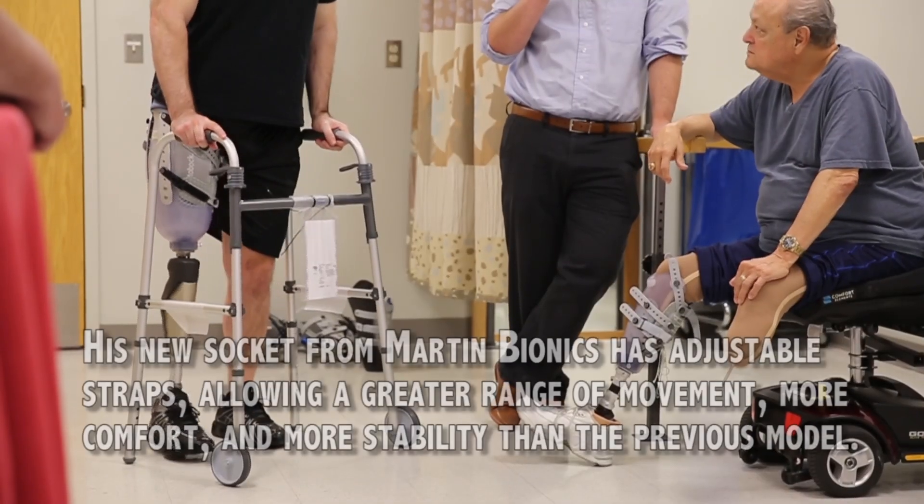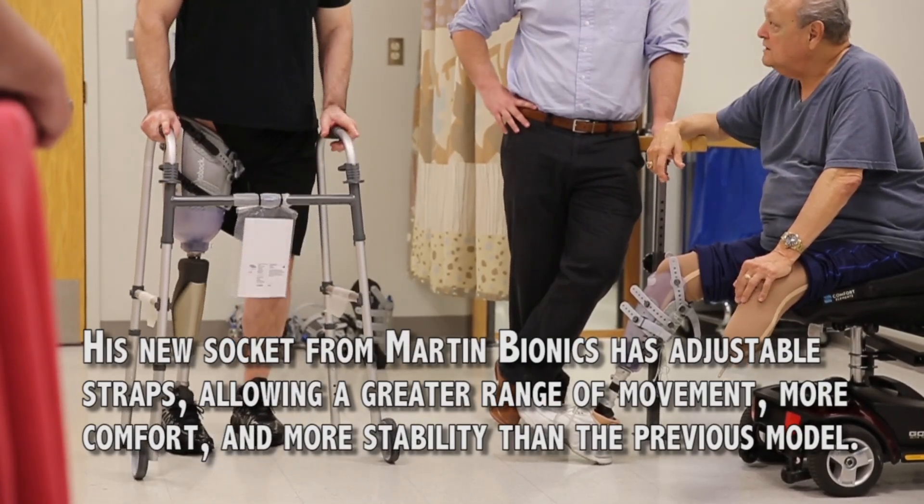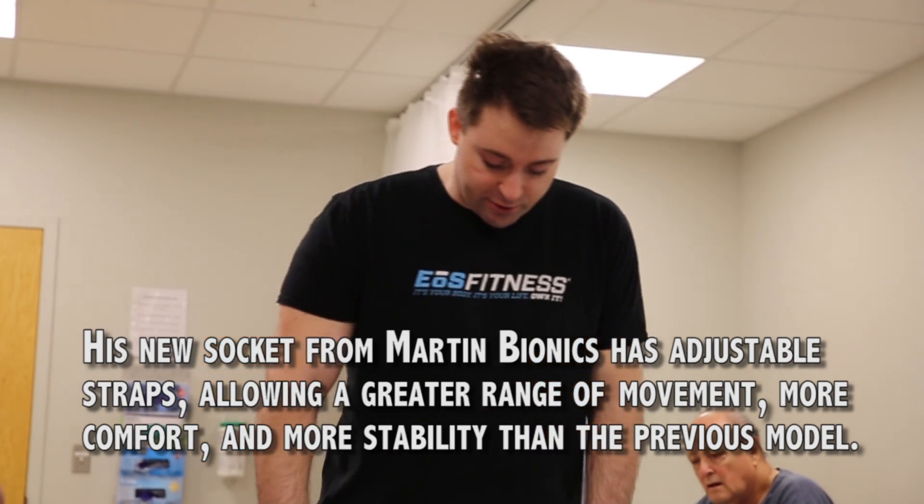It's felt a lot smoother, a lot lighter, a lot easier to use — just a lot lighter for one. It just bends a lot easier. The first thing I'm going to do is try it out at the gym and see how it works.